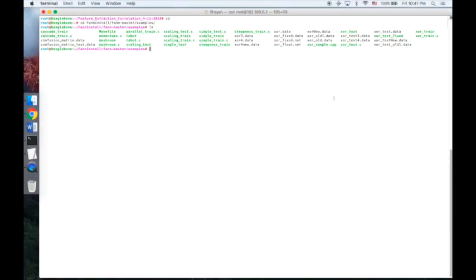Now we're moving on to the machine learning algorithm and display how the neural network works here. So far we have collected 4 features, and those are autocorrelation of acceleration y from sensor 1, mean of accel y data from sensor 1, mean of acceleration z data from sensor 2, and mean of gyrometer z data from sensor 2. Those numbers were mapped to the range of -π/2 to π/2 using an arctangent function, and thus we created a training dataset and testing dataset. I will display the training dataset and testing dataset and perform training and testing for the system using the FANN library.